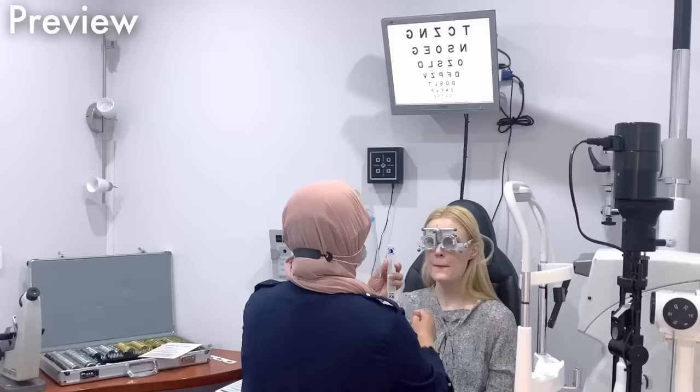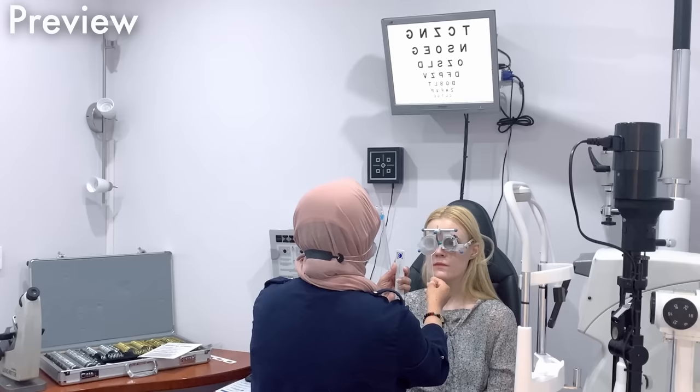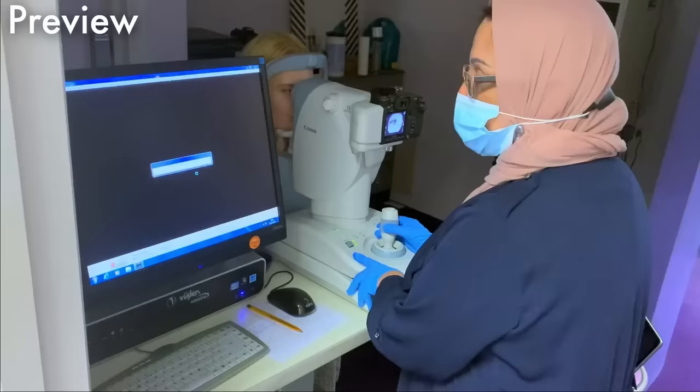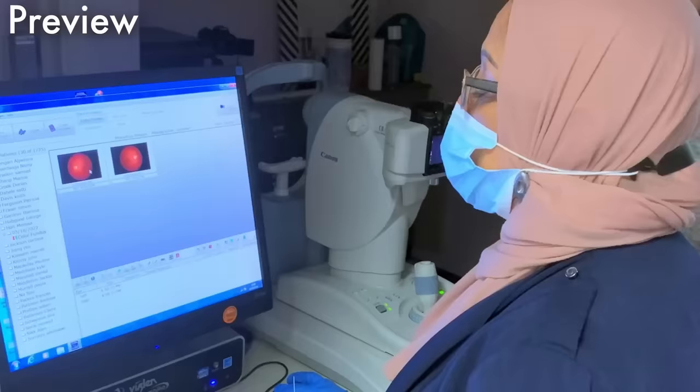Concentrate on the F. Thank you. Watch the F. That's perfect. Well done, that's great. And blink. Good. Keep looking at the green dot for me. Keep very still. Excellent. Beautiful image, that's lovely. Okay, so this is the back of your left eye. Oh, wow. Absolutely beautiful, yeah.